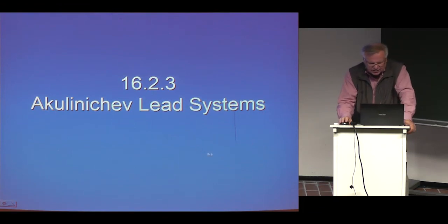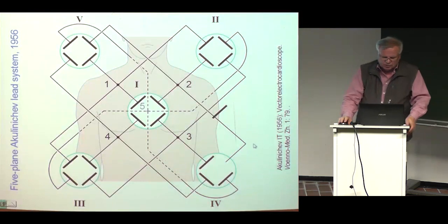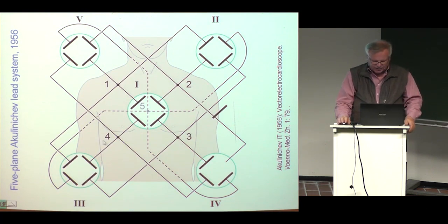As a curiosity, I tell you about Akulinichev system. Somehow this is complicated, but somehow I like it. Here are Mr. Kovarchuk and Ivan Timofeyevich Akulinichev in Moscow in 1968. So Akulinichev had a five-plane lead system where the recording electrodes are on the chest here, and one electrode on the back in this location, amplifying the signals and feeding them to the deflection plates of the oscilloscope gives the Akulinichev system.